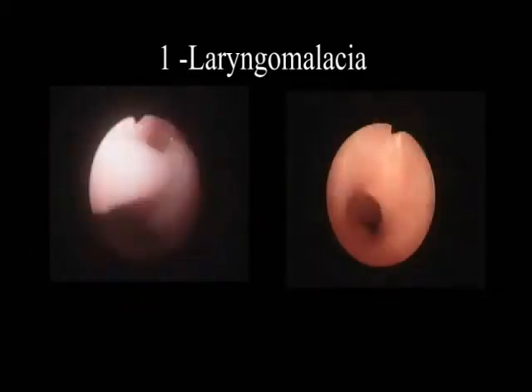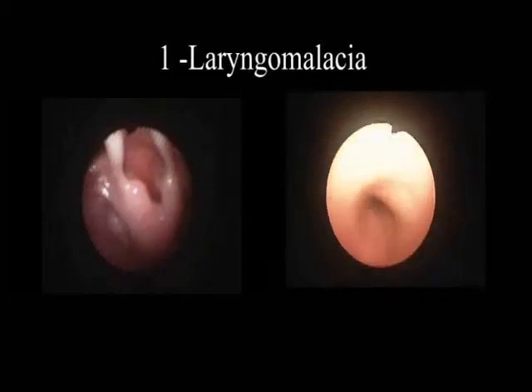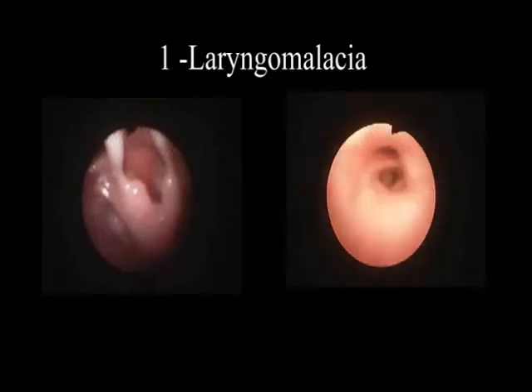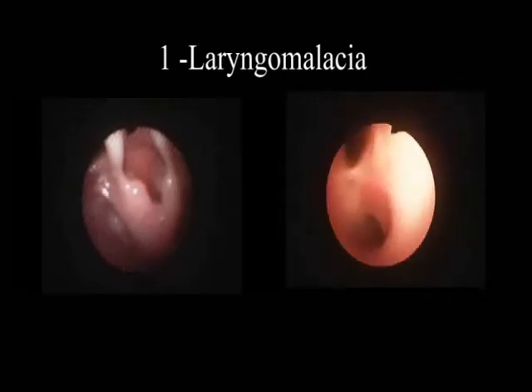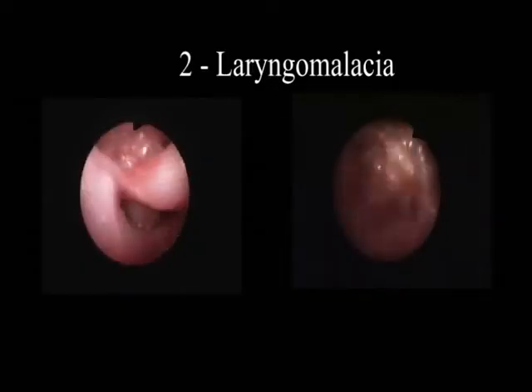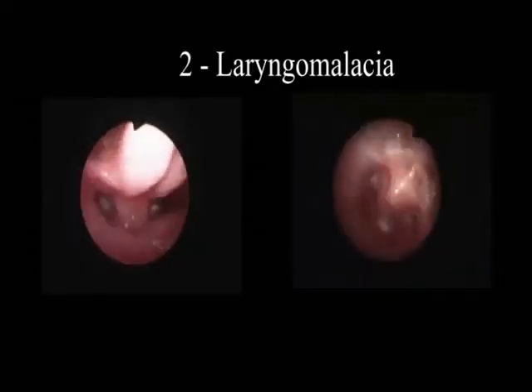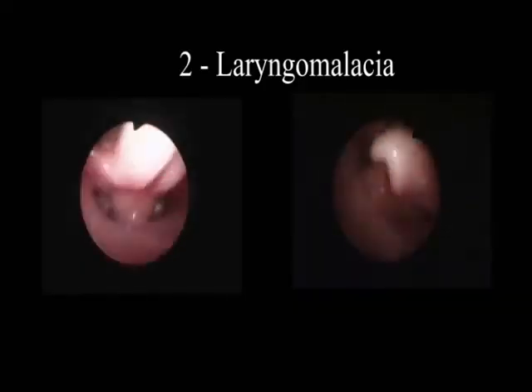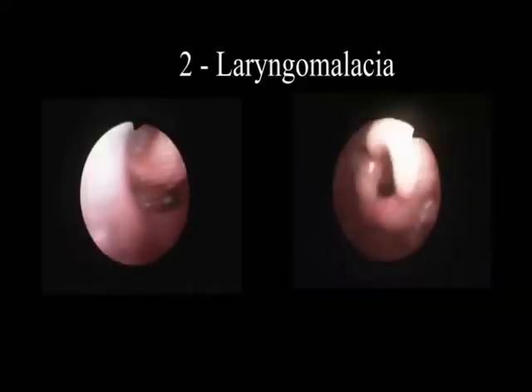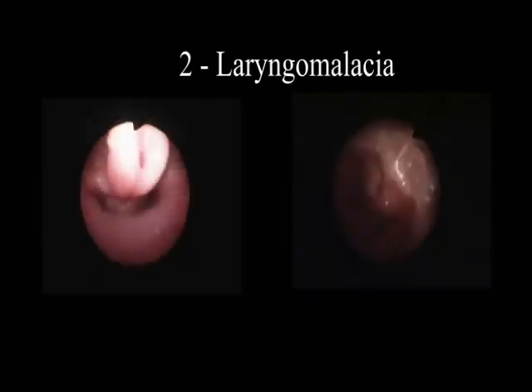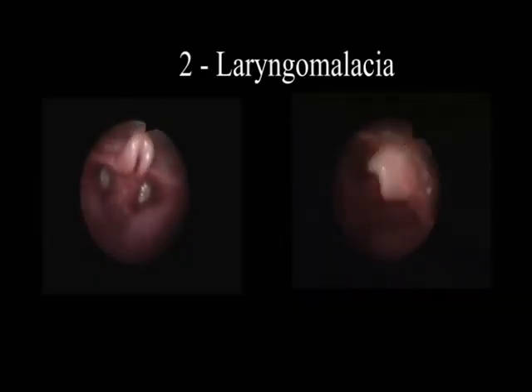The larynx shows an omega-shaped epiglottis, cuneiform prolapse, and short aryepiglottic folds. The tracheobronchial tree may be examined for additional anomalies. In laryngomalacia, the prolapse is in the supraglottis, either posterior redundant mucosa and accessory cartilage, due to posterior displacement of the epiglottis in the glottic inlet.